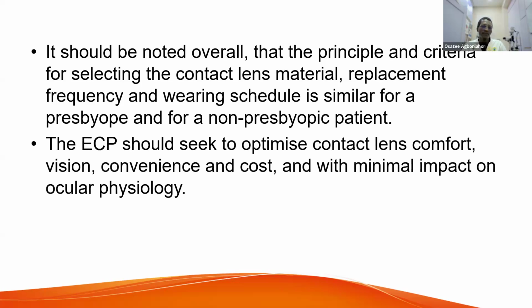The eye care practitioner, okay, this is eye care practitioner. One of us asked that I give the full meaning of ECP. So it's eye care practitioner. Every eye care practitioner should seek to optimize contact lens comfort. That's one of our goals as it concerns our clients. It's not just all about good vision, but comfortable vision, good and comfortable vision, as well as ensuring that it is very convenient, cost-wise, and of course, has minimal, underline that word minimal, impact on ocular physiology.